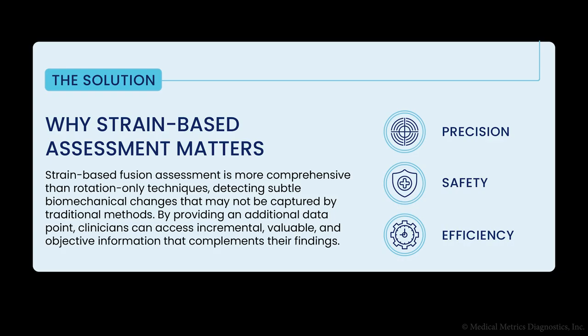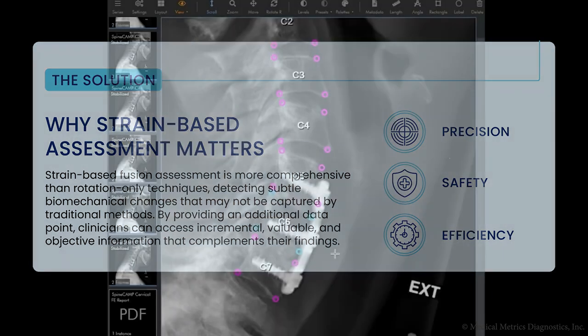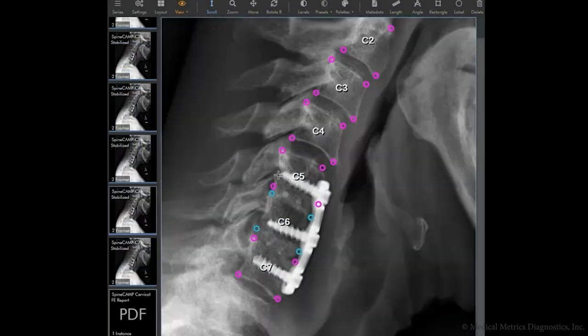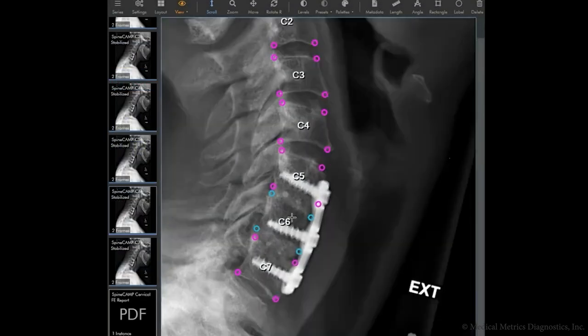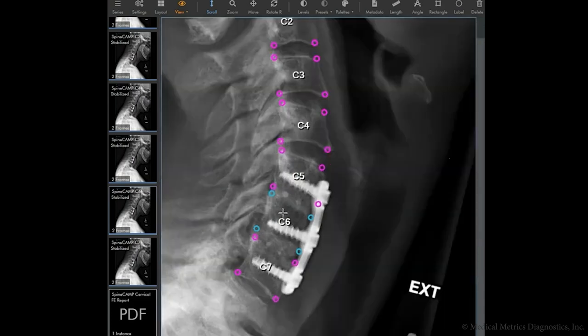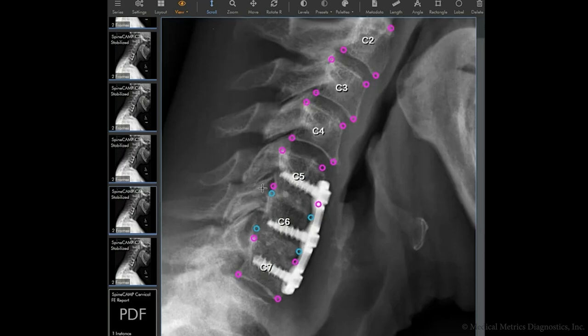One of the main goals of ACDF is to join two vertebrae together by encouraging bone to grow between them. Strain-based fusion assessment combines the physical and x-ray evaluations of this bone growth. By taking precise measurements from x-rays acquired when the patient bends forward and backward, we can calculate the strain across the disk space. If the measured strain is low enough, it means the bones are stable and likely fused successfully.